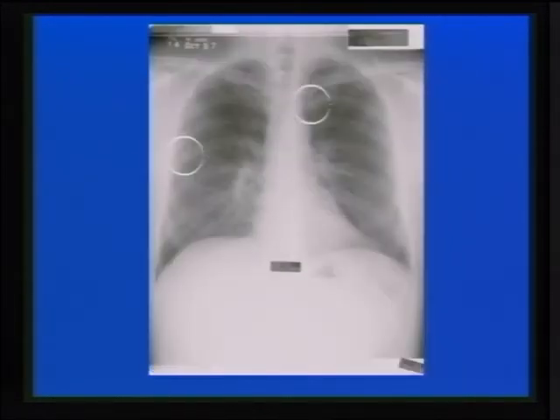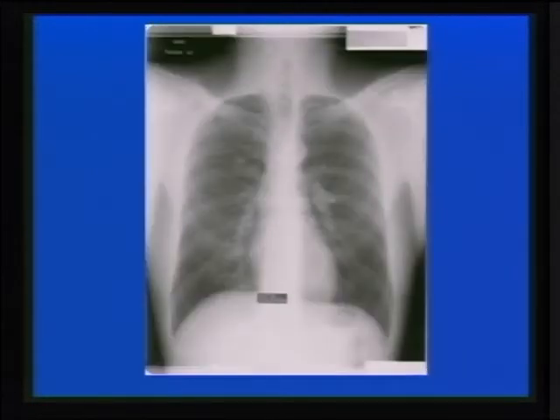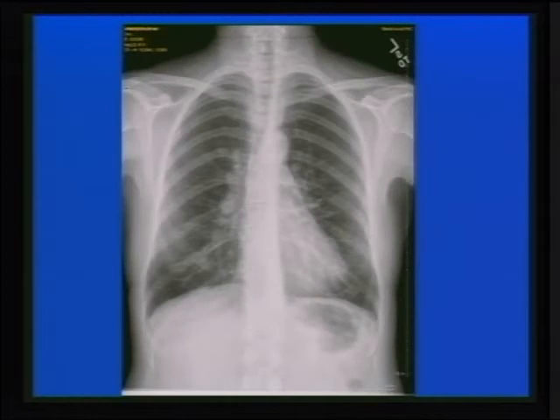I guess I don't have much time, but the other technology that we have is computer-aided detection, for which there is a region of interest that is highlighted. So just like a second reader, it's going to highlight an area that the computer thinks is suspicious. The problem with this is you see too many false positives, but you as a radiologist have to determine what's a true positive and what's a false positive. But it does allow you to enhance your ability to detect lesions.